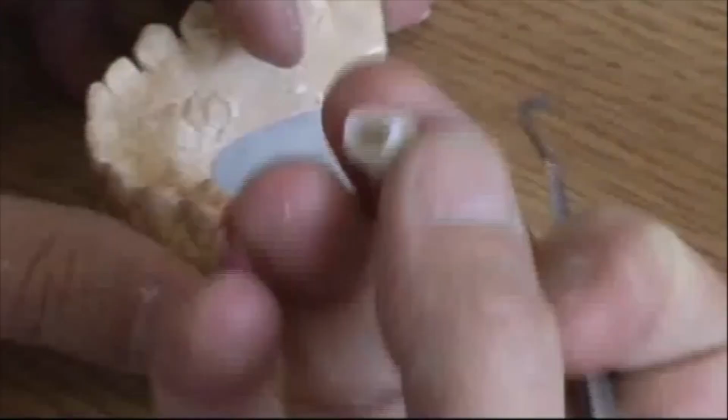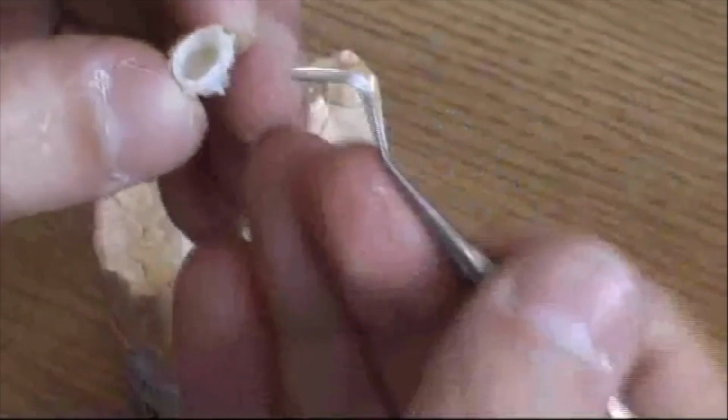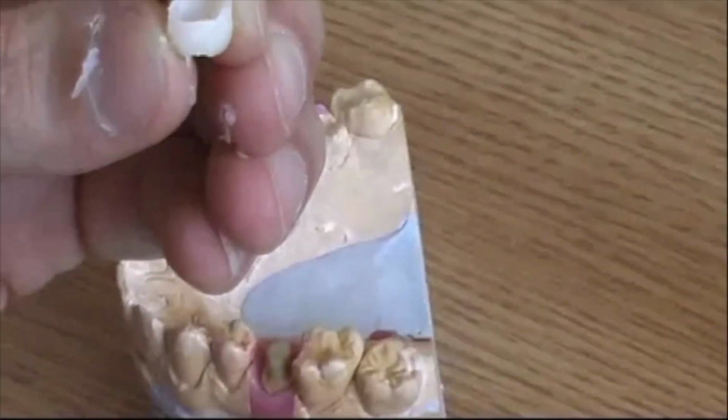We mimic the mouth. And you see the abutment and the temporary. You see the margins of the temporary, how clean they are, how nice they are. And of course, we have to trim it now and polish it. And then we have it. That's it. Directly in the office.